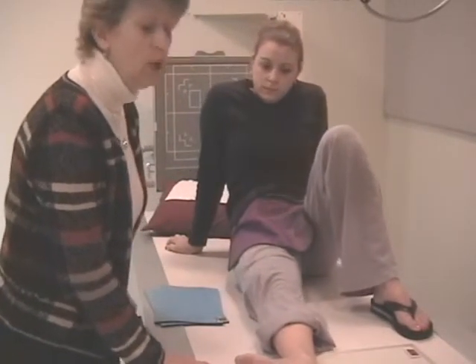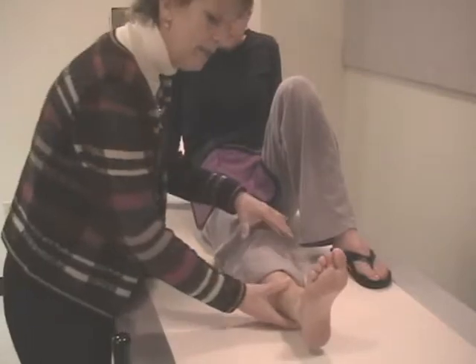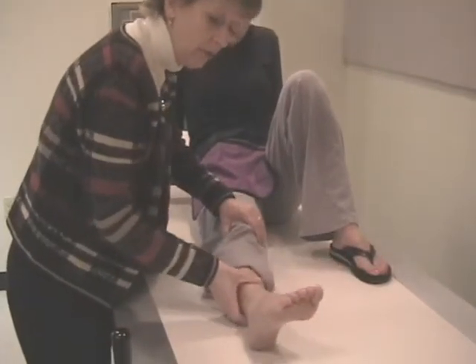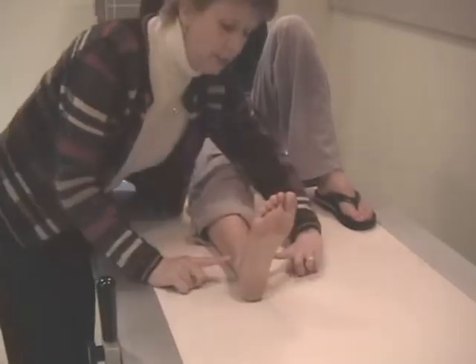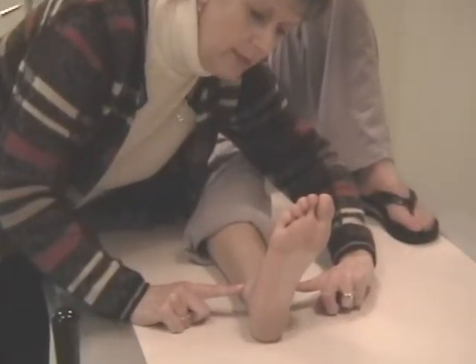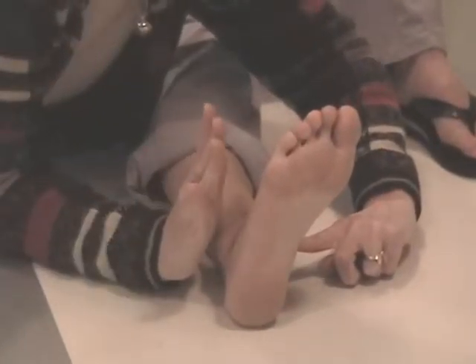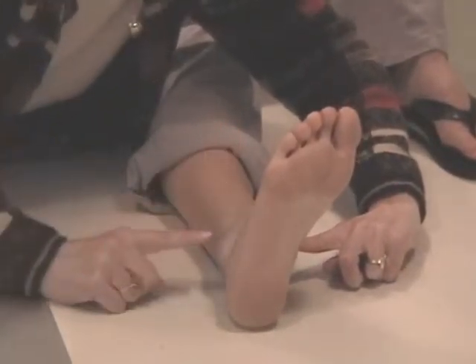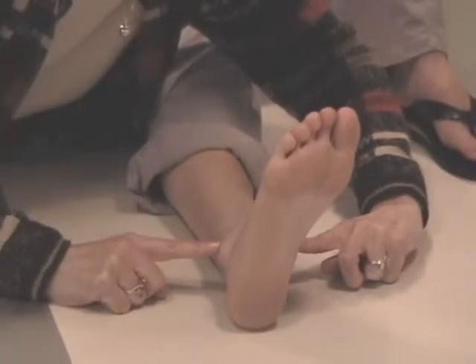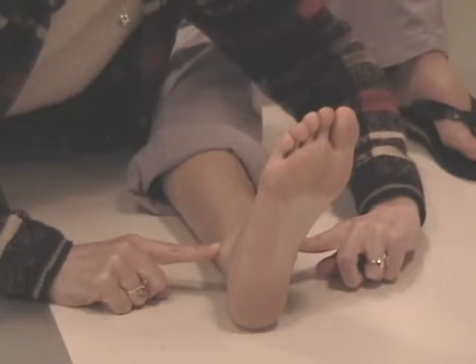In our area, we want our lateral with the malleoli superimposed. When I showed you the AP mortis, that was a slight degree of obliquity, foot flexed, intermalleolar line was parallel. Okay? And on Jacqueline, it was about 15 degrees off of vertical. That's with the intermalleolar line parallel. What's 90 degrees opposite to parallel?